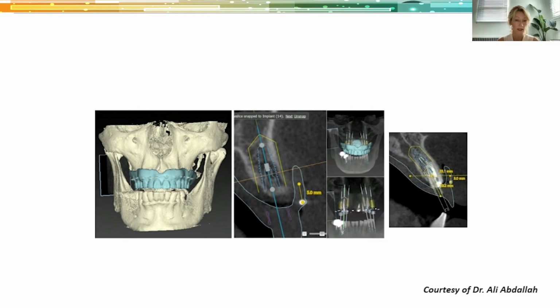If the implants are positioned in such a way that we will use straight multi-unit abutments. If we're going to use angled multi-unit abutments, we have to calculate for that as well because they might have wider collars and we have to place the implants deeper. But this is all the information we need in order to hide that prosthetic margin.